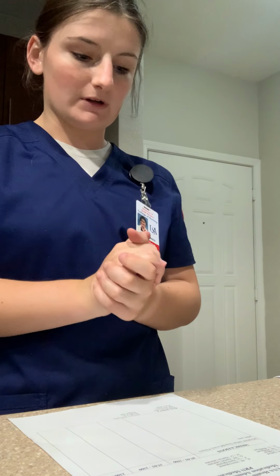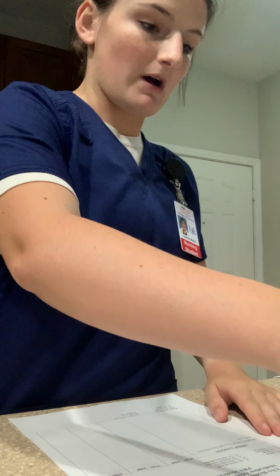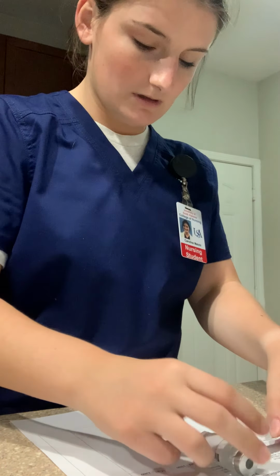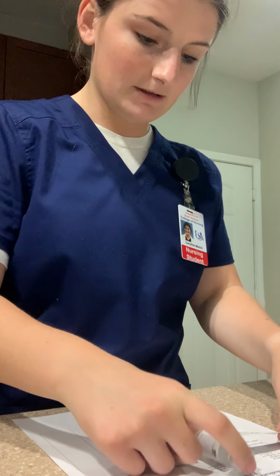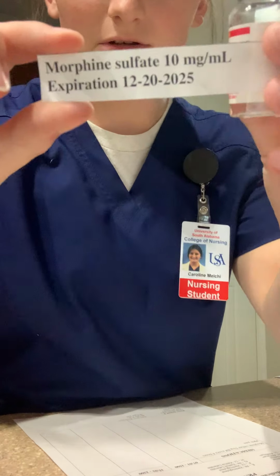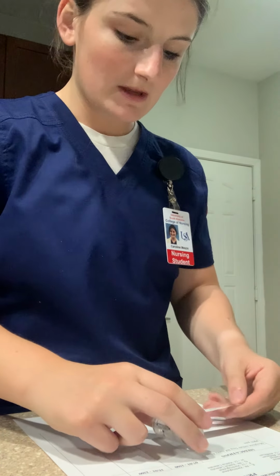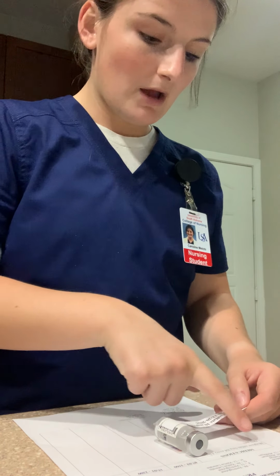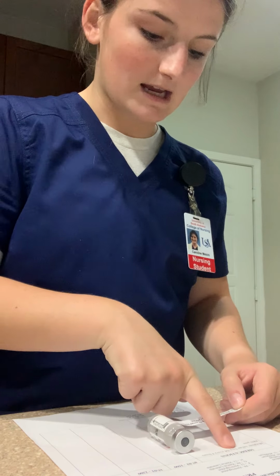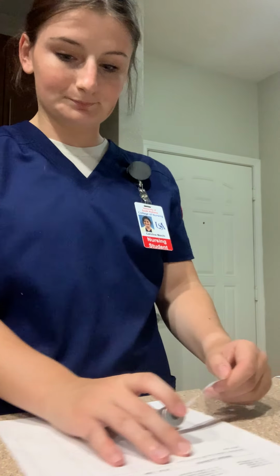I will first select my drug. So I will take my vial and compare it to my MAR. So it is morphine sulfate. It is not expired. I'm going to show this. I'm now going to do my calculation. So my vial says 10 milligrams per 1 milliliter, and my MAR says I only need 5 milligrams, so I will be doing half a milliliter.